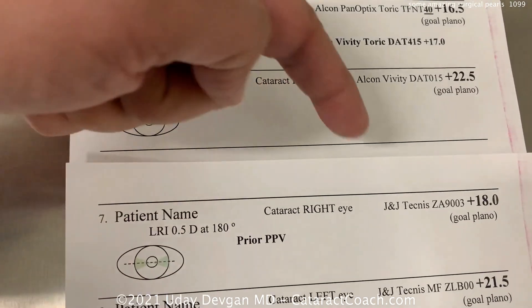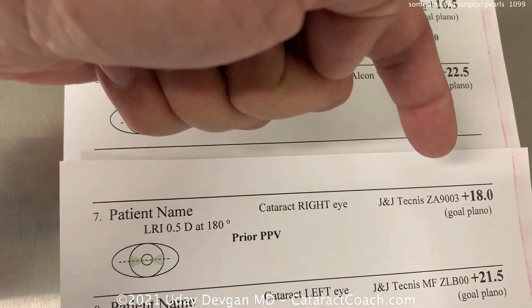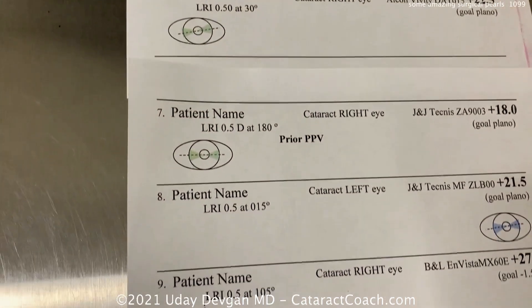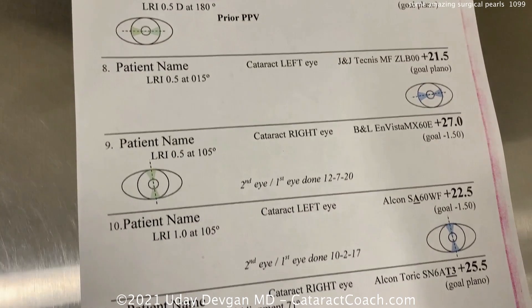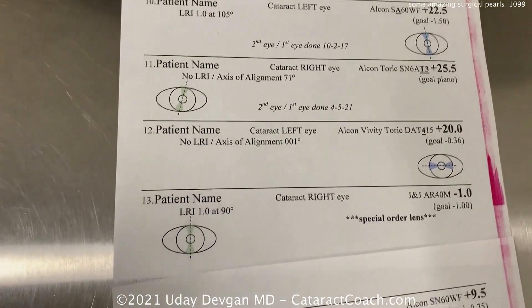This patient had a prior pars plana vitrectomy. We're going to use a three-piece acrylic lens with a goal of about plano. Remember: adding a half diopter to the IOL calculations in patients with prior vitrectomy. So we go through the list — various types of lenses.